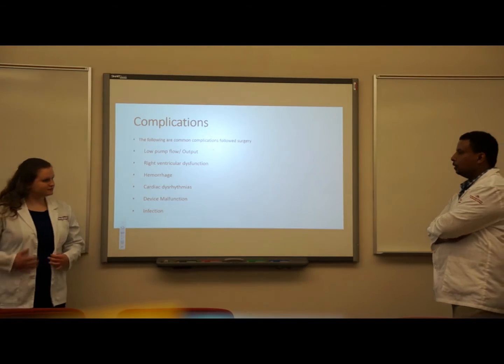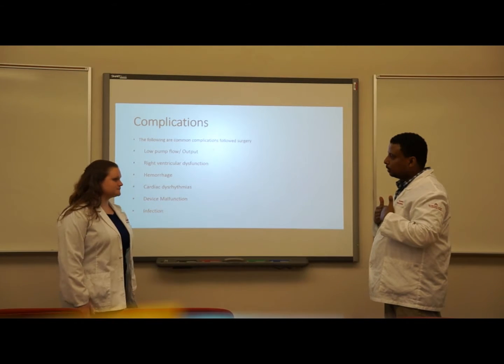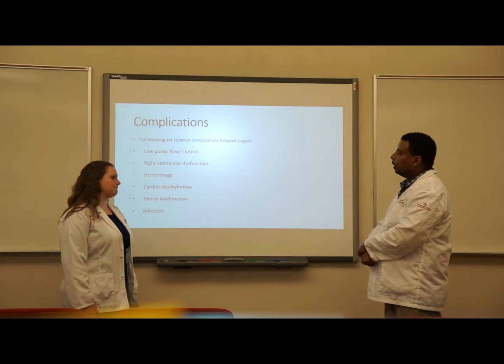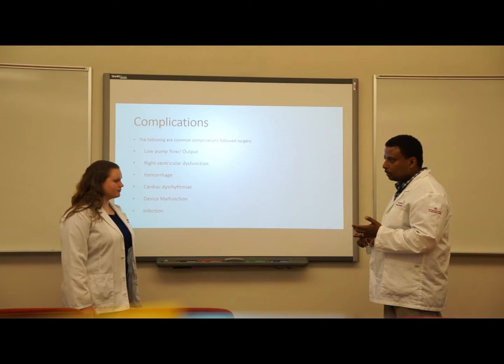So I have a question. Sure. So this device is implanted inside the heart? Yes. And you have a control outside? Mm-hmm. Okay. And then you talked about a bridge versus destination.